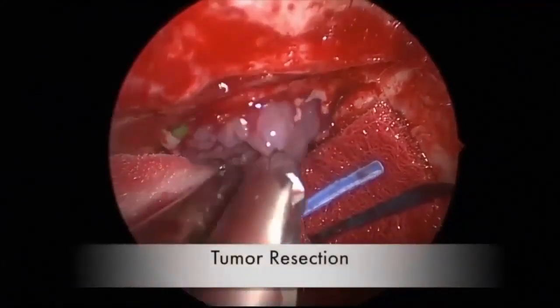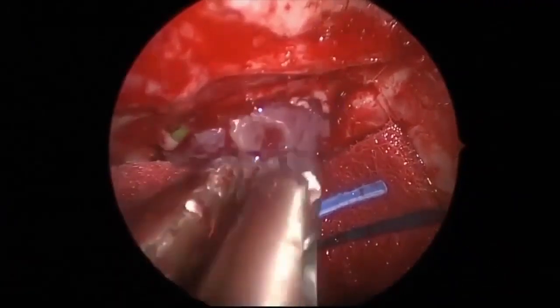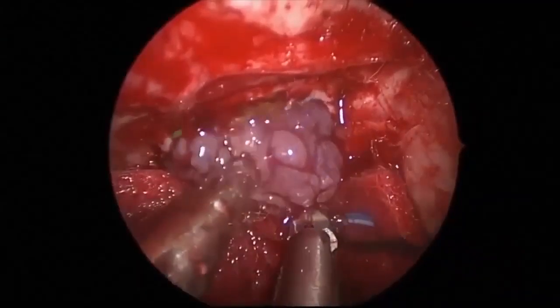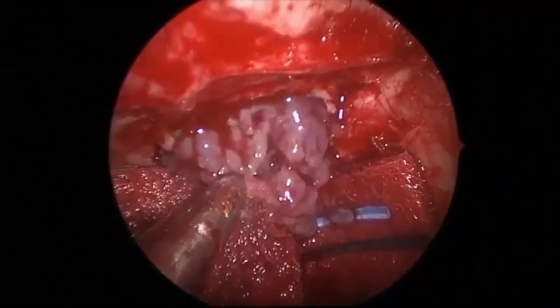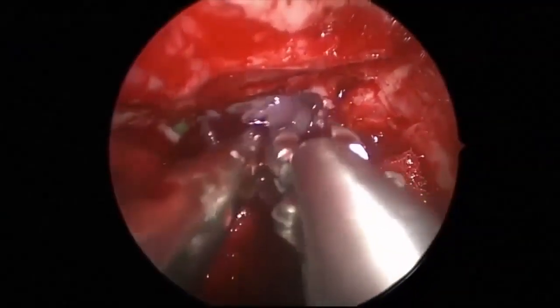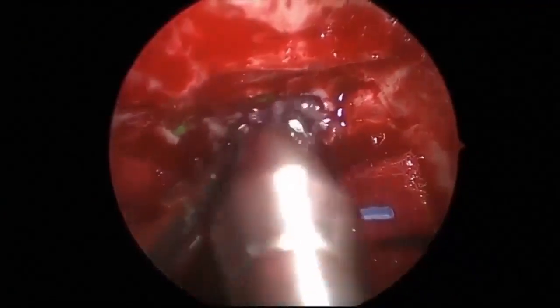The tumor is then rolled down. There is often an excellent arachnoid plane. The tumor can be internally debulked at this point to ensure adequate visualization, and frozen and permanent sections can be sent from this relatively soft tuberculum sellae meningioma.